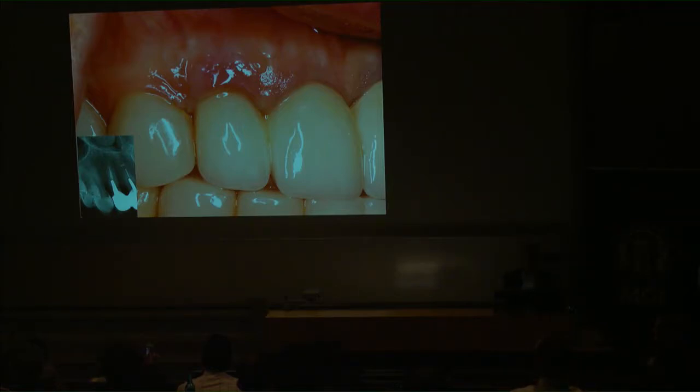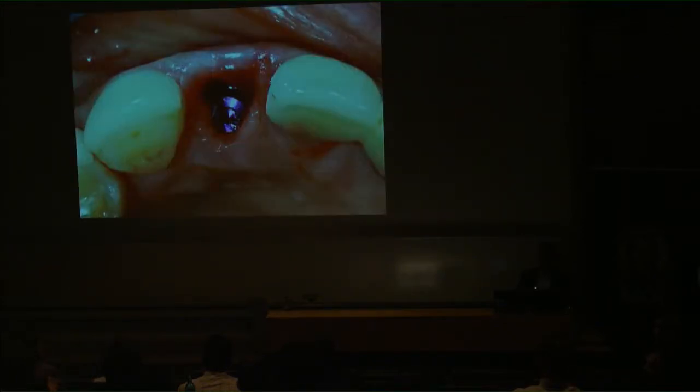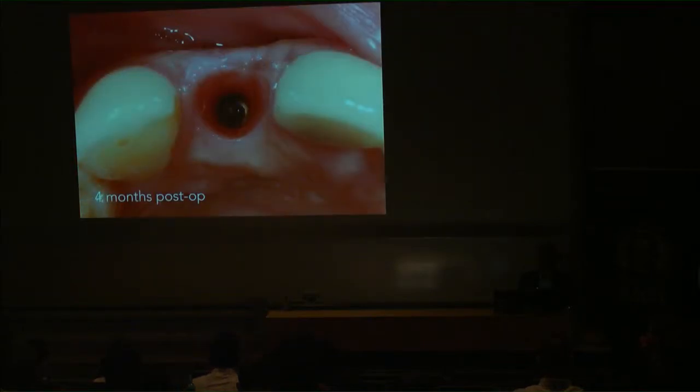Root fracture with lateral periodontal abscess. Typical thin buccal bone plate. Implant placement in the direction of the cingulum, allowing more than 2 millimeters of buccal gap. The treatment was done according to the immediate protocol: atraumatic extraction, small implant diameter placed toward the palatal aspect, subcrestal placement allowing thick vertical soft tissue, and proper emergence profile.